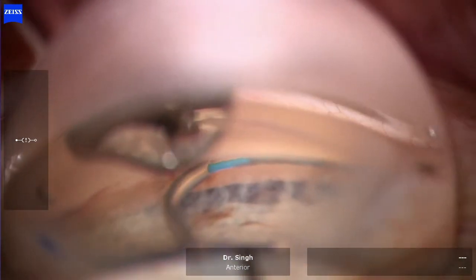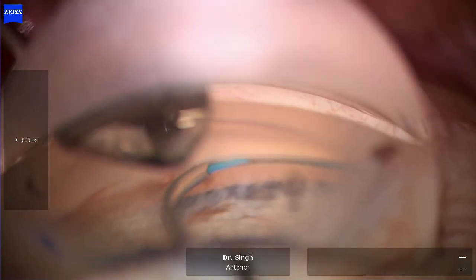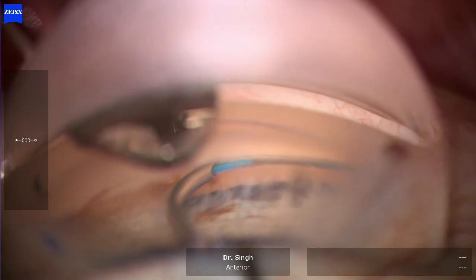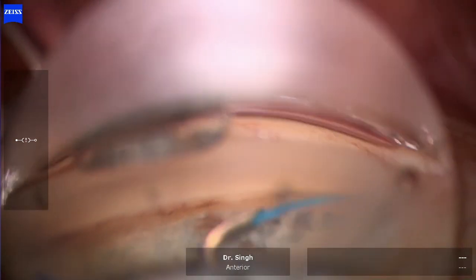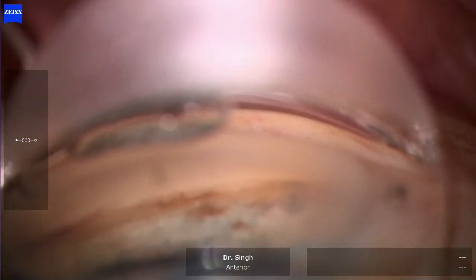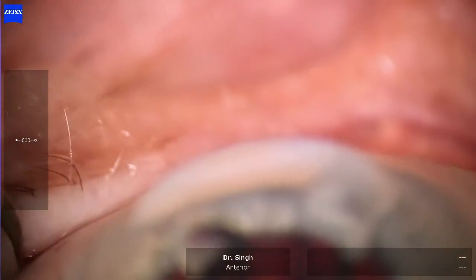I'm advancing it until it stops, then retracting it back — don't come out, just retract it back, stop, and then re-advance it. Now I'm going to perform my trabeculotomy — there you go, going circumferentially. Pull it out and we are done. Hope that helped, thank you.